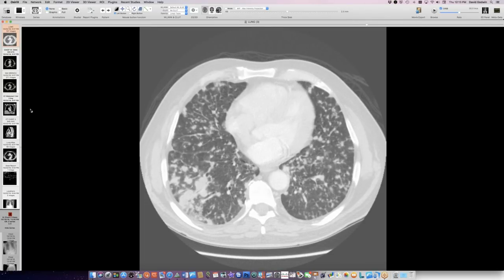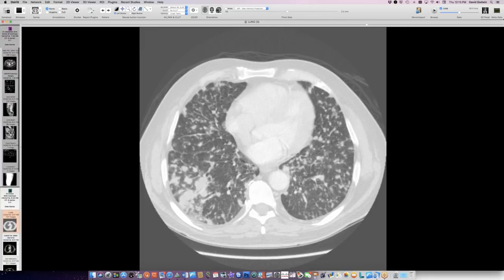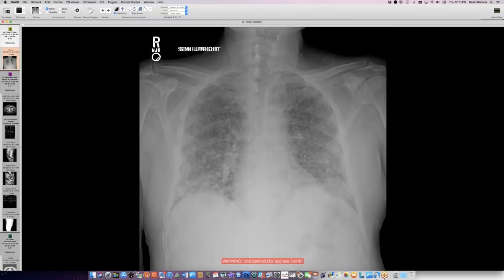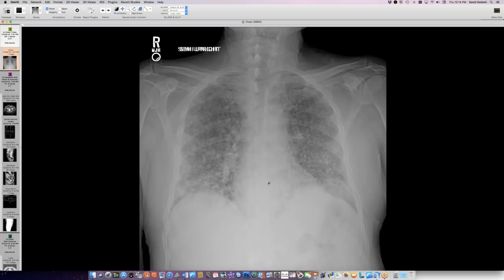So I had a whole bunch of things in mind, and then it grew out MTB. And then in two weeks he died of MTB. He's one of the 25% of people with miliary tuberculosis that can't be saved. This is a later radiograph on him showing this stuff was not going away — still has the larger nodules in the bases, he's gotten lower lung volume, and then he died about two days after this. So it was TB, which was the top of our list at the beginning. I wasn't quite confident about that because of those smooth, larger basal nodules and the lack of lung irritation. Common things are common, and this was miliary TB.